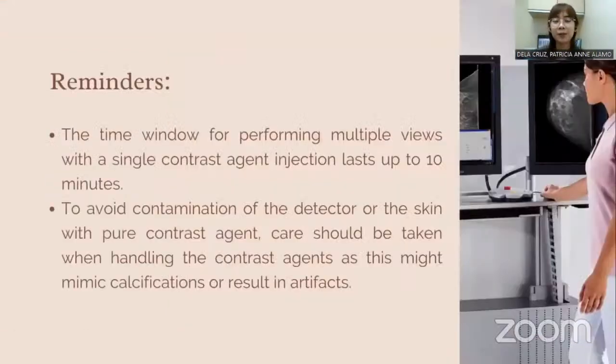So the time window for performing multiple views with a single contrast agent lasts up to 10 minutes. So you have 10 minutes to position the patient and to know if there's any additional views that the doctor is going to request. After these 10 minutes, you may lose the contrast effect.